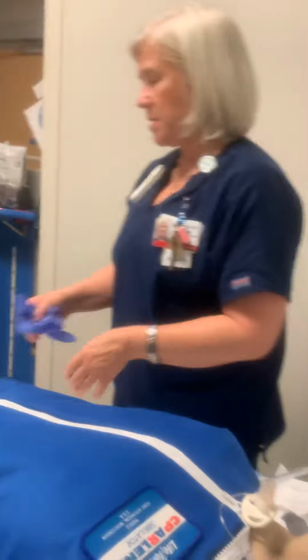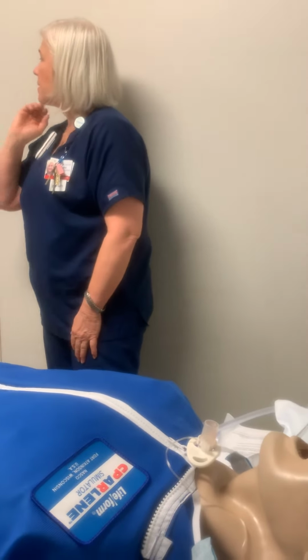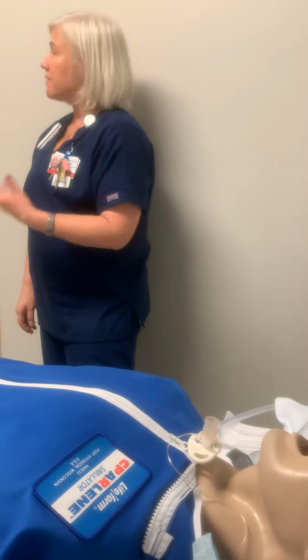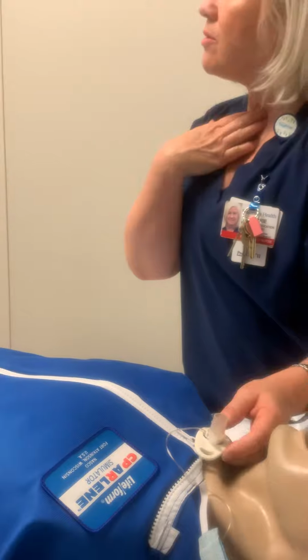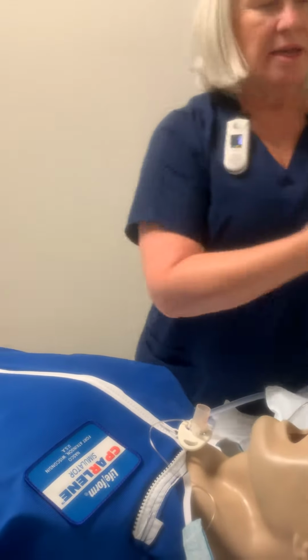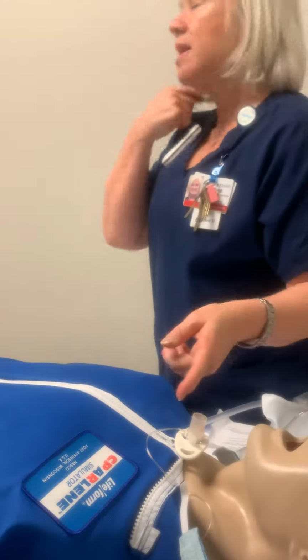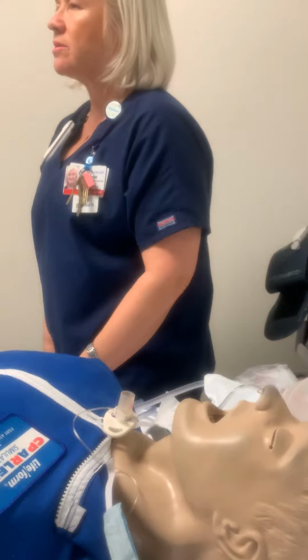Okay. Is there a particular order for cleaning the trach and suctioning? No, it does not matter. I usually like to suction first and then clean it. Because a lot of times when you're up here manipulating this, they're going to start coughing all that junk up. And so you're like, oh great, now I have to unglove. So I usually like to suction first. And even when you're messing with this trach when you're cleaning it, even after you suction them, it's still going to stimulate them to cough more. So then there's more stuff coming out.